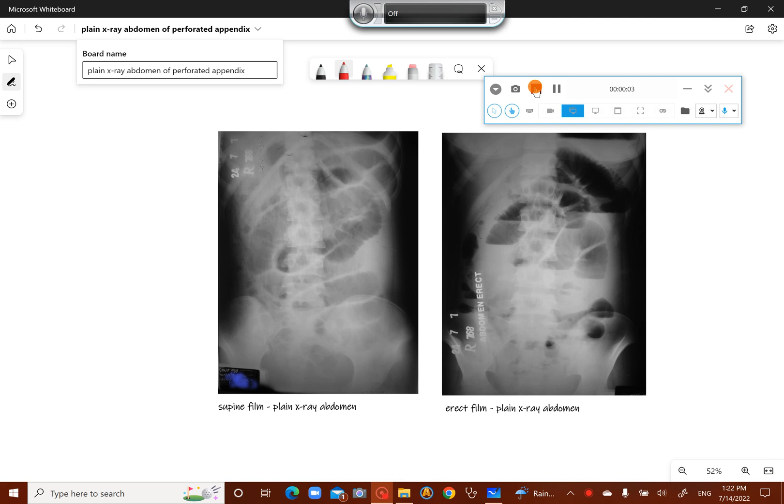Bismillahirrahmanirrahim. These two X-rays are of a patient who had a perforated appendix, and the X-rays reveal intestinal obstruction.